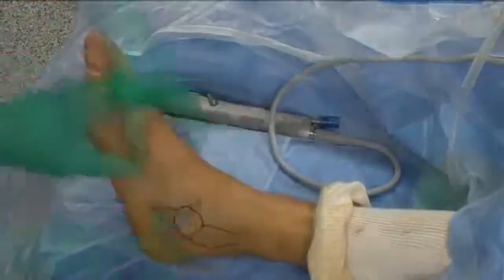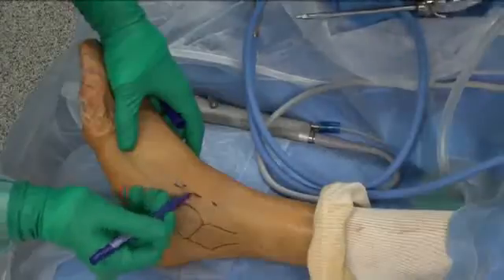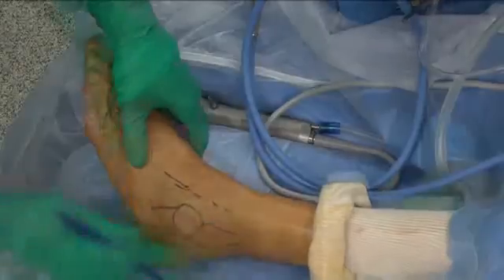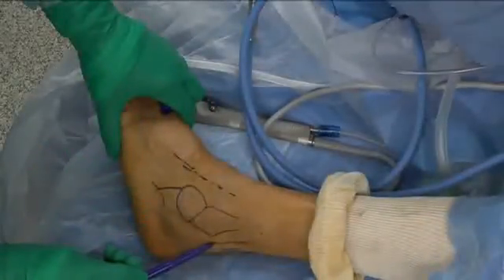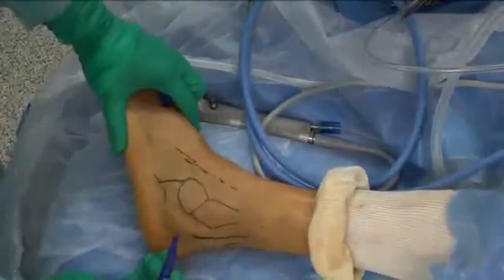The superficial peroneal nerve may be seen in some patients and, if possible, is outlined on the skin. The theoretical position of the sural nerve is halfway between the lateral malleola and the Achilles tendon.